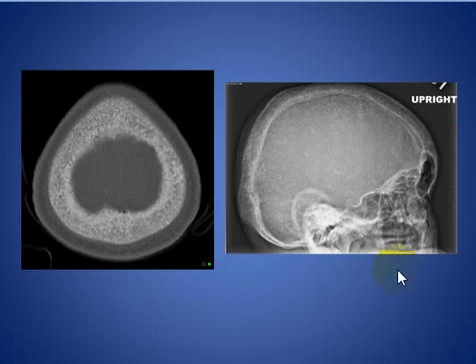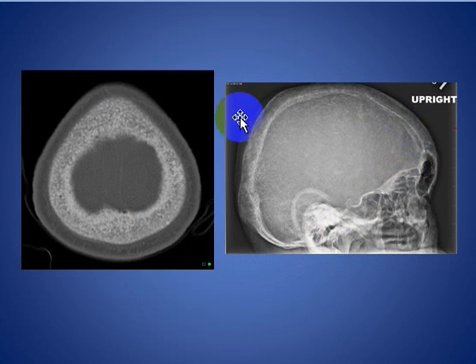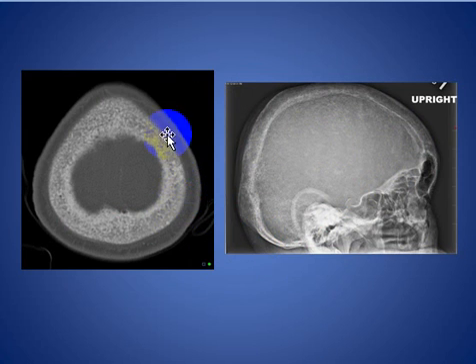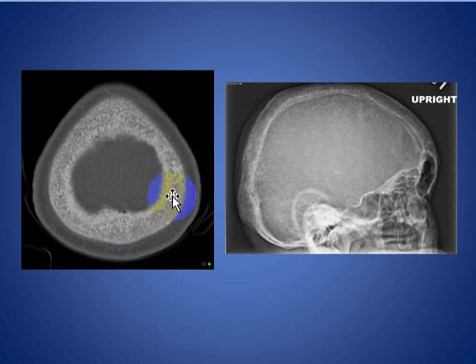Here is a patient with hyperparathyroidism showing diffuse skull vault thickening with the salt-and-pepper appearance sign. This is also seen on axial CT at the vertex, demonstrating the classic salt-and-pepper sign of hyperparathyroidism.